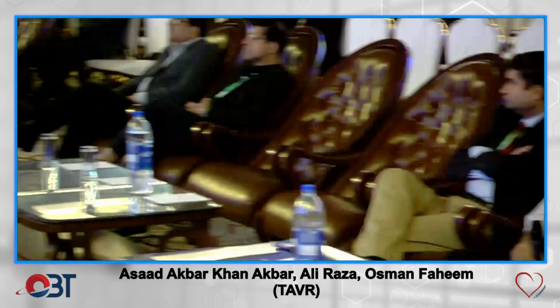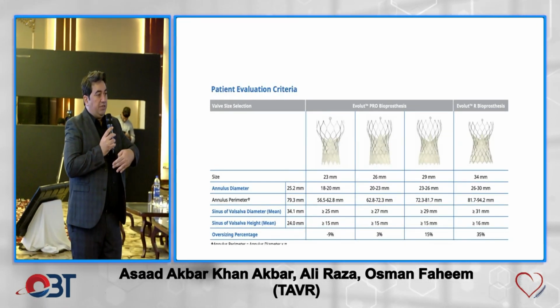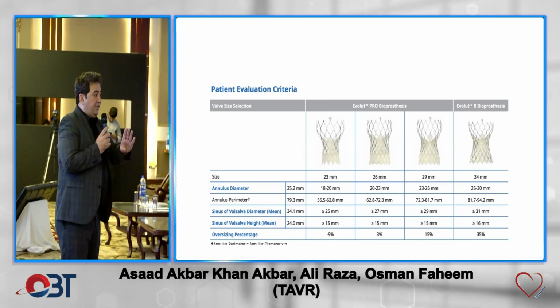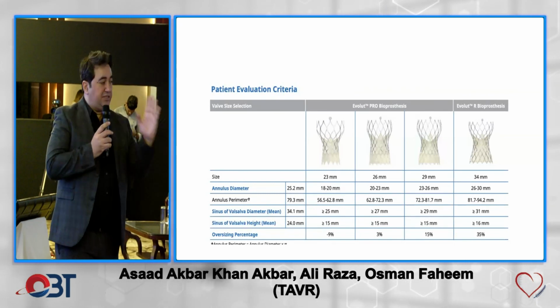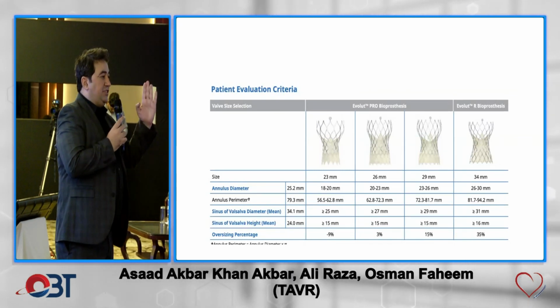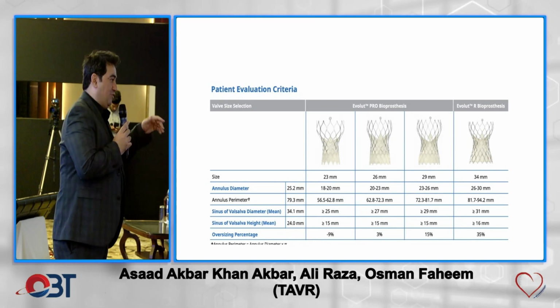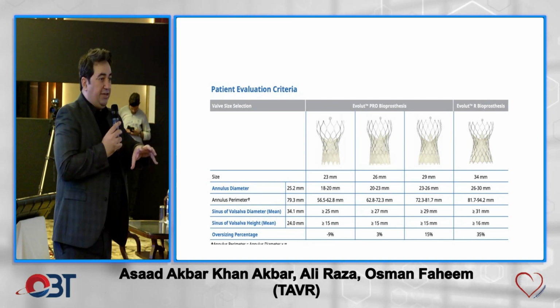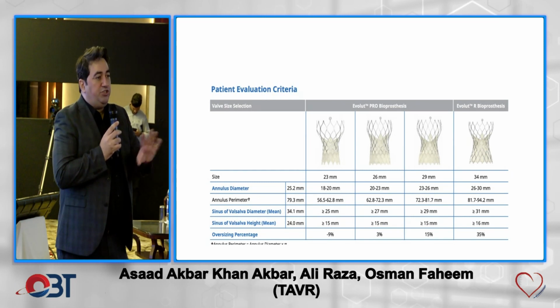अक्सर आप प्री बलूनिंग के साथ देख भी सकते हैं, बहुत रफ आइडिया है, इस पर रिलाई मत करें, लेकिन it can happen कि आप प्री डिल कर रहे हैं, उस टाइम आप एओटोग्राम करें, देखेंगे वो करते हैं. लीफलेट्स की हाइट अगर आपकी STJ तक पहुंच रही है, सपोज करें, तो मतलब ये अब कुछ भी फ्लो नहीं जाएगा उसमें साइनसेस में फिलिंग के लिए डायस्टली के टाइम. तो ये 2-3 चीज़ें, लेकिन इससे आप प्रोसीजर से नहीं रोक सकते.